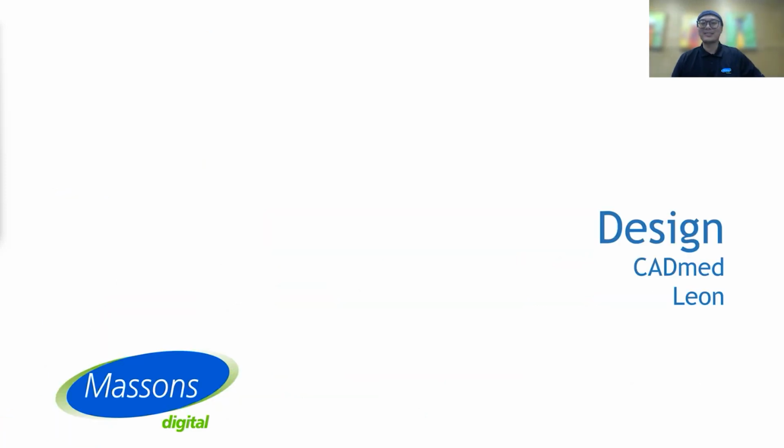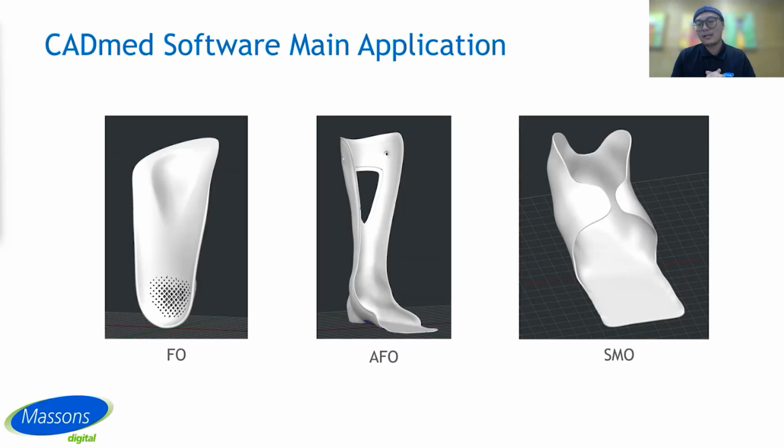Hello, everyone. My name is Leon, a 3D digital OMP designer. This is the design segment. In this part, I will introduce the main applications and basic operational processes of CADMed. Let's get started. Right, the current main application areas of CADMed include FO design, AFO, and SMO design. It can generate carving models for milling machines or fully digital product models for 3D printing based on the user's needs. I will show you step by step how CADMed can quickly modify and design models.